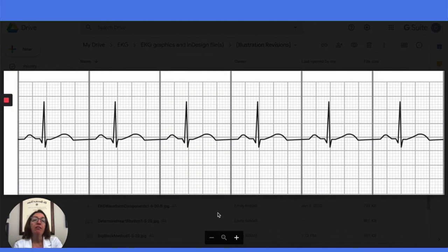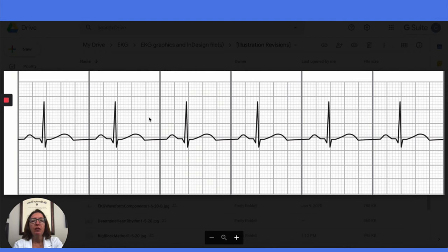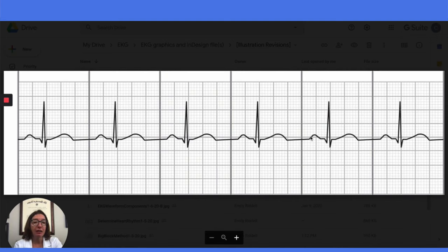Here in this strip, we have normal sinus rhythm. So let's go through our different steps in interpretation. If we look at the rhythm, we can see that it is regular. So we would get our calipers out, measure from R-wave to R-wave and from P-wave to P-wave, and we can see that it's totally regular.